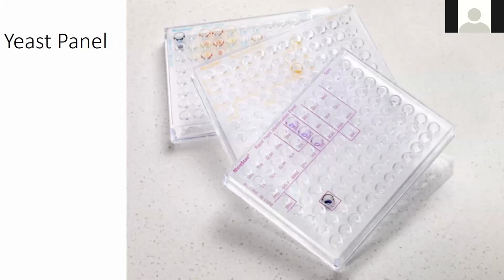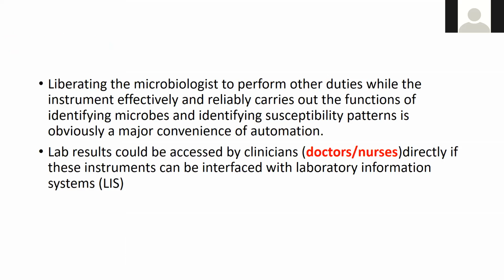Yeast panel, that's what we were going to use. We were going to use an API yeast. They make it for everything. So the microbiologist now has other time to work on other things. Maybe get more involved. Maybe have time to work on the antibiogram and keep an eye on that daily instead of waiting each month to put it together.